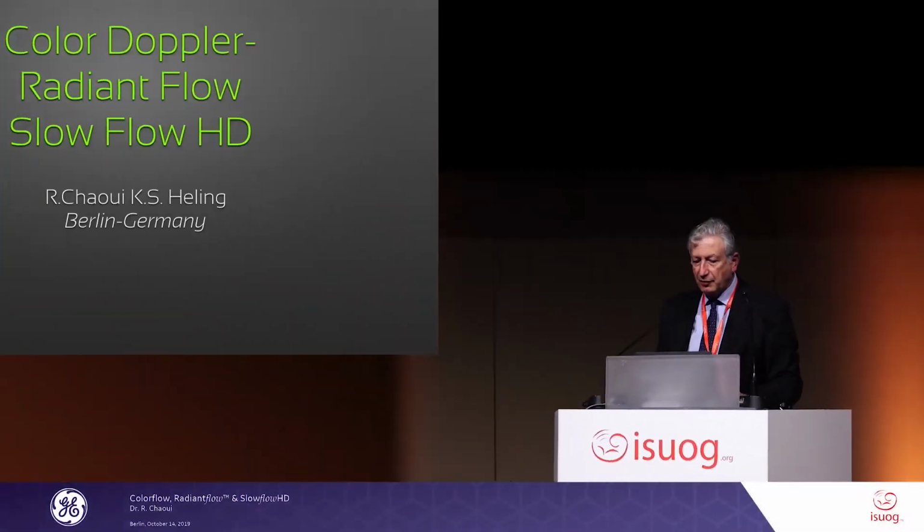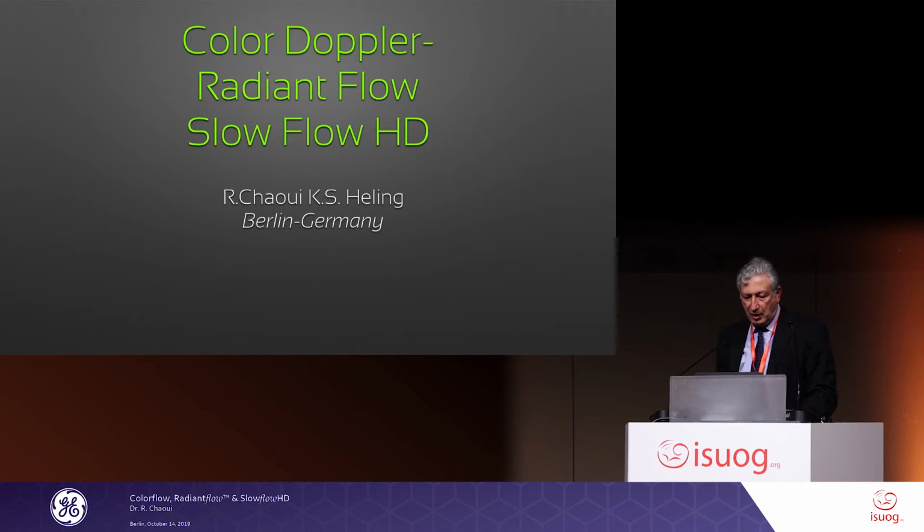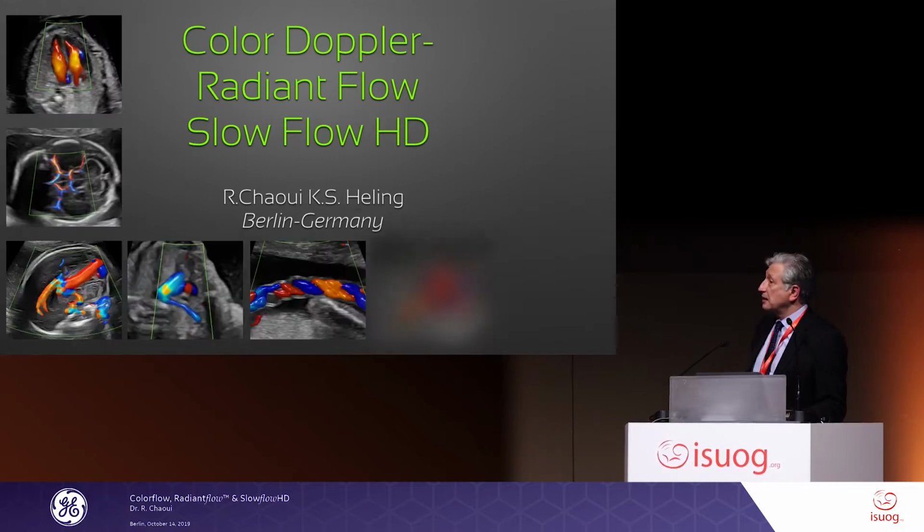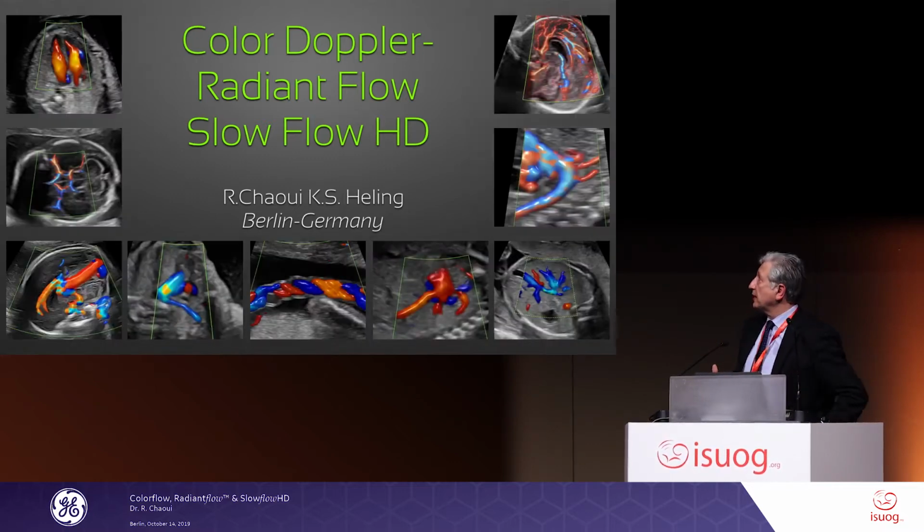My talk will be dealing with color Doppler, Radiantflow, and SlowflowHD high definition. The idea was to put all these together because I'm not switching from one technique to the other, but I'm using all three together, so that I can see the details I need. The aim of my examination is always to get the most precise information possible. This is why I combine all these technologies.